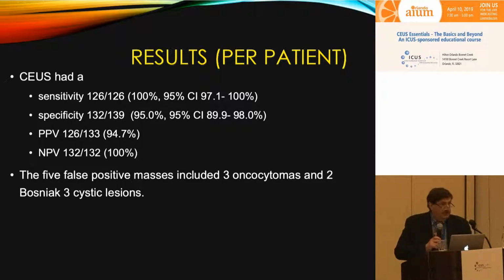for 10 years. So we think with additional prospective studies, it may be that if we do an ultrasound with contrast and see that the lesion does not have any flow, following the lesion every year, even if it's a Bosniak 3, may not be appropriate or not needed.